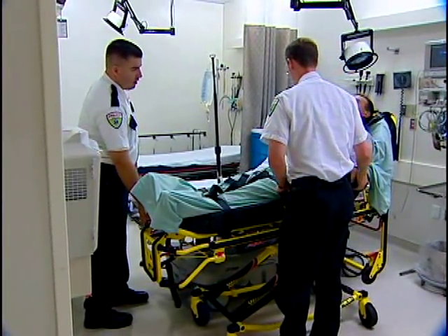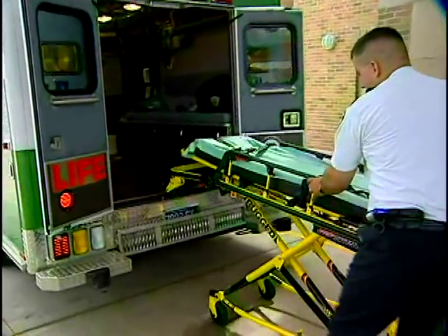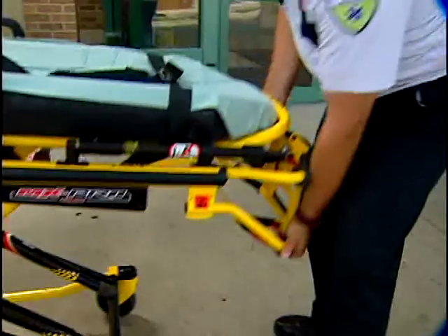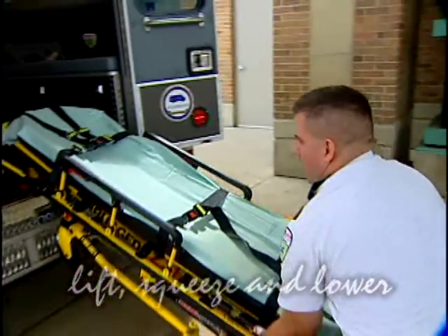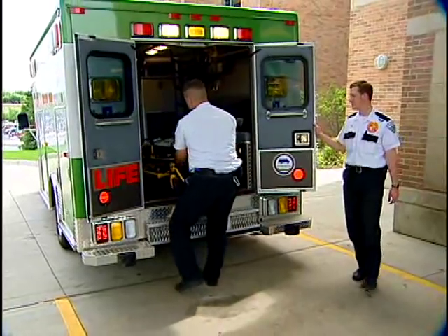One operator can load the MX Pro without a patient. Just approach the back of the ambulance squarely, roll the safety bar over the safety hook and then back against the hook to be sure the legs will clear the bumper. Lift the litter frame slightly, squeeze the height adjustment release handle and lower the foot end to the ground. Then lift the cot to horizontal, roll it into the ambulance and engage the cot fastener.